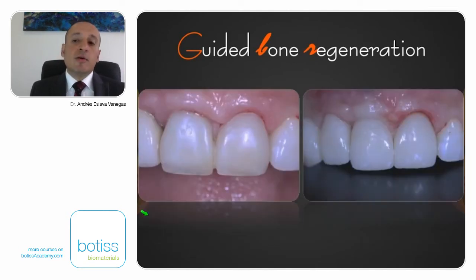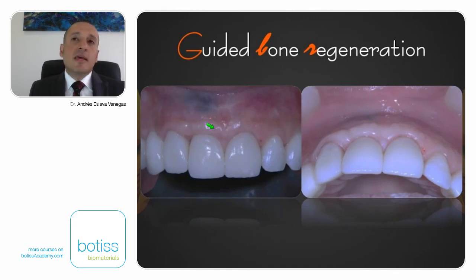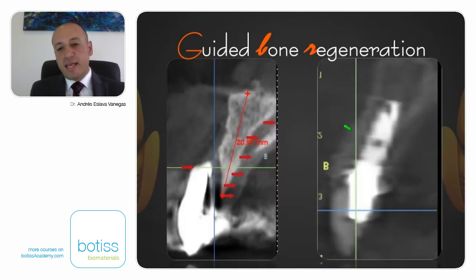Okay, at the moment of the second surgery, the prosthodontic doctor made these temporary crowns over the implant. We have this scarring here, so we used some electrosurgery to eliminate this scar. And you can see here the patient 6 years after the surgery. Look at the thick, really thick biotype. Look at here. This is the natural tooth, this is the dental implant. This is the best slide that I have for this case.